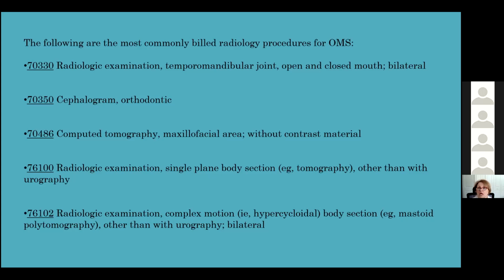So what's the most common in most offices? I could tell you that most offices are using 70486, but they're not reading all of 70486. They're reading only what they want to treat. And that is not okay.